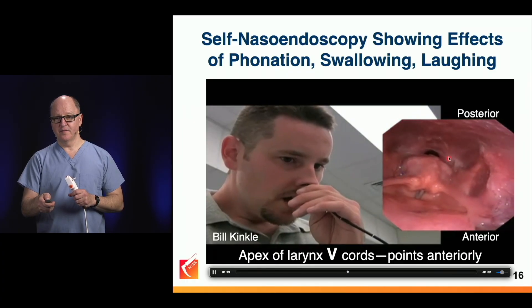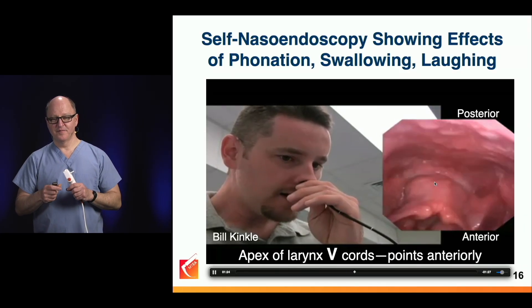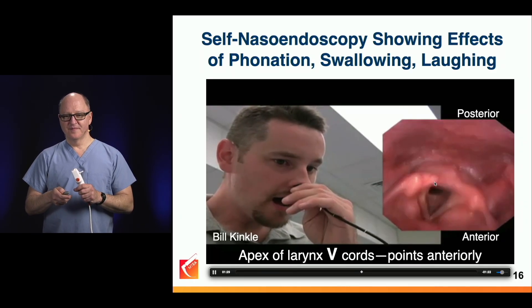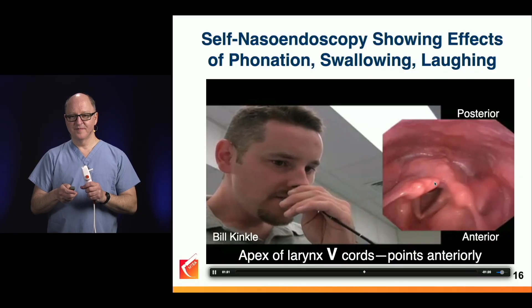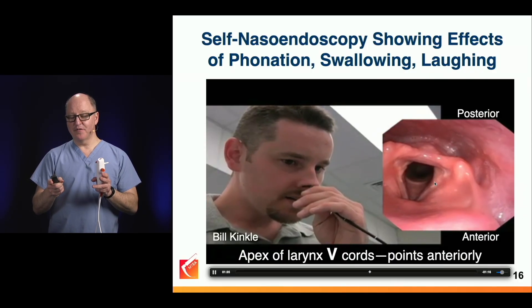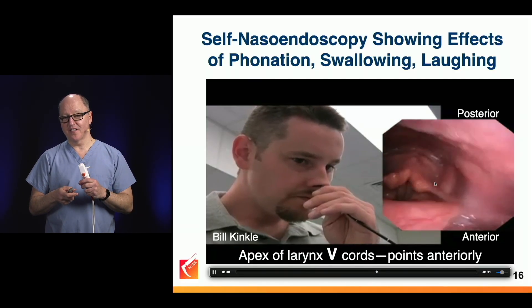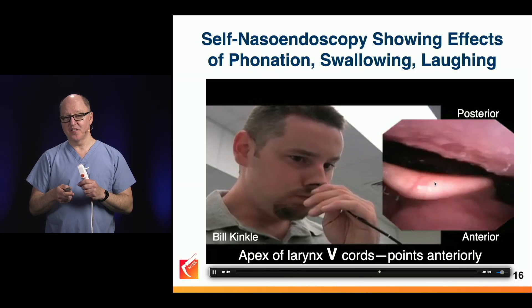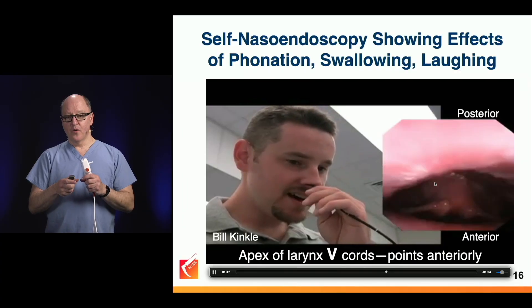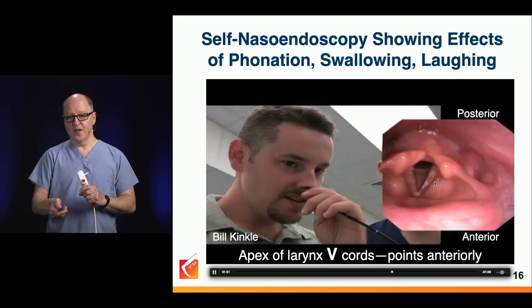Wait for it — there it is. Bill had reflux in the past, and on this image you can see his larynx looks good. He doesn't have any evidence of erythema or irritation that we would see with reflux. With phonation, the cords are coming together, and we're seeing that very well here.